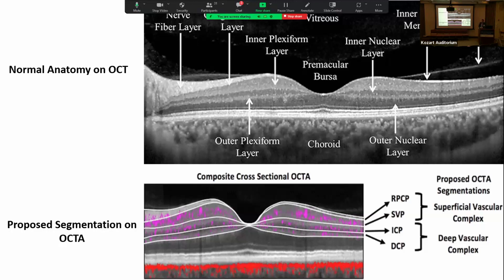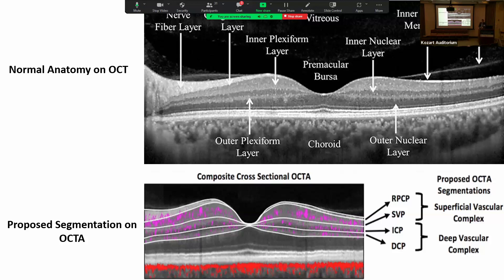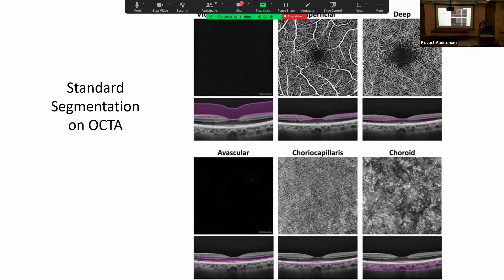Let's review normal anatomy. The picture on the top is just a standard OCT showing the different layers of the retina. On the bottom, you've got the cross-sectional OCTA showing the different capillary plexuses of the retina. You've got the RPCP — the radial peripapillary capillary plexus — and the superficial vascular plexus, which is in the RNFL and ganglion cell layer. Then the intermediate and deep capillary plexi are straddling the INL. OCTA segments this into a superficial vascular complex and a deep vascular complex. It also produces an avascular segment for the ONL, which is a watershed area — very important clinically for lesions like PAMM.